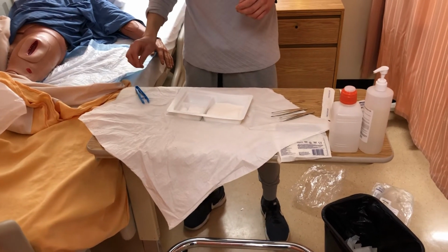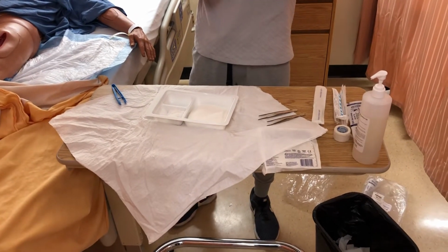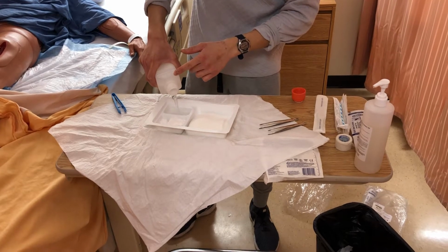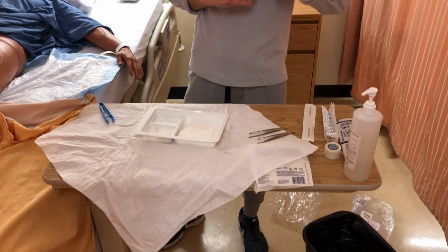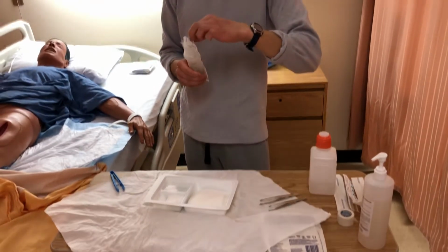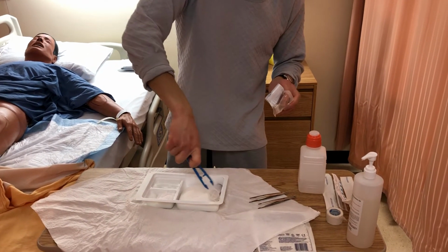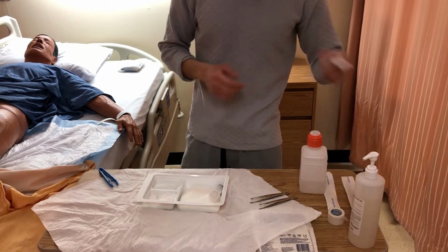And now I'm going to get my normal saline first. It looks to be not expired, so I'm going to fill the empty tray with normal saline. So after doing that, I'm going to go into the patient's room. And now I will get my 30 ml syringe, which I will fan back. And I'm going to put my syringe in here. And now I'm going to discard of this, and I'm going to get my 20 gauge IV Cathlon.